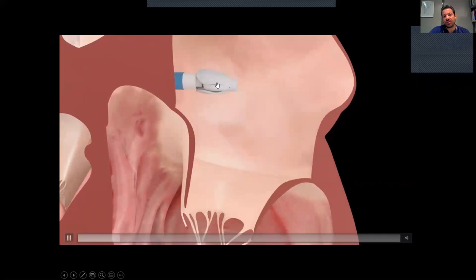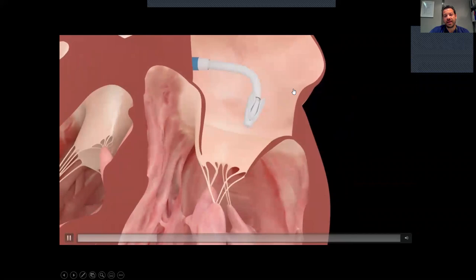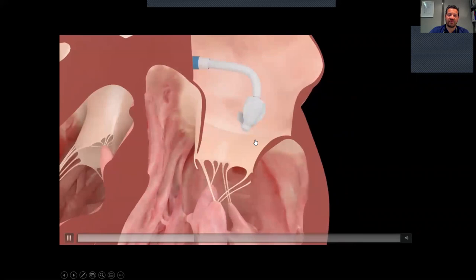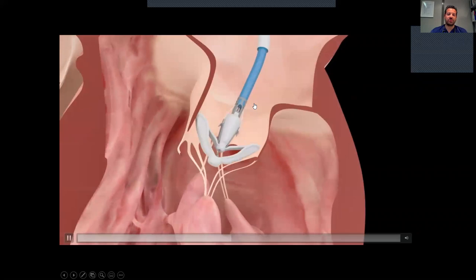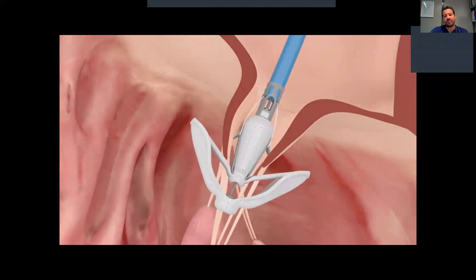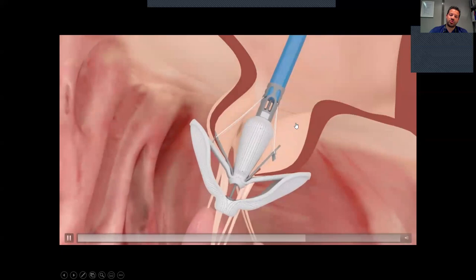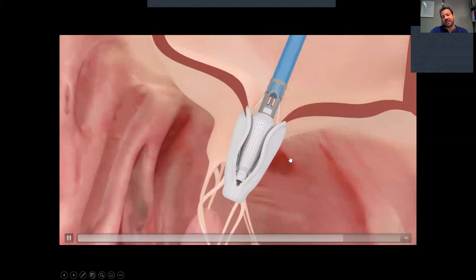As you can see in this animation video, the device comes elongated into the left atrium, and then we retract back the paddles in order to gain some space. We turn the device to the MitraValve and check the perpendicularity, because we want to go perpendicular into the left ventricle. Then we go into the left ventricle and retract back to make sure that the leaflets are on the paddles.